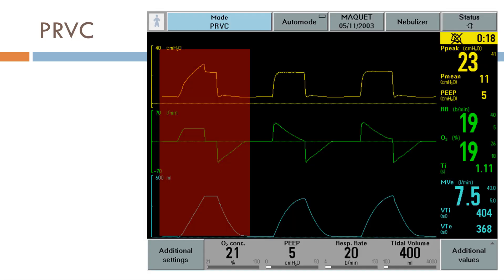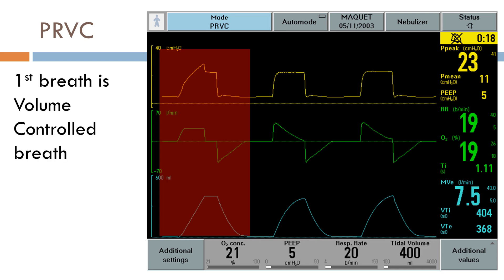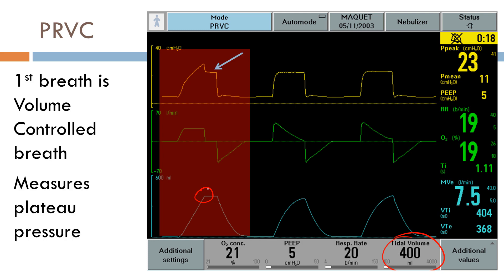So here's PRVC. The very first breath ever delivered by PRVC is actually a volume-controlled breath. You can see here that the flow is completely constant, affirming that this is a volume-controlled breath. The volume will increase up until our desired volume of 400 milliliters. Once we have reached 400 milliliters, the computer does an automatic inspiratory hold to determine the plateau pressure, essentially to figure out the lung compliance.